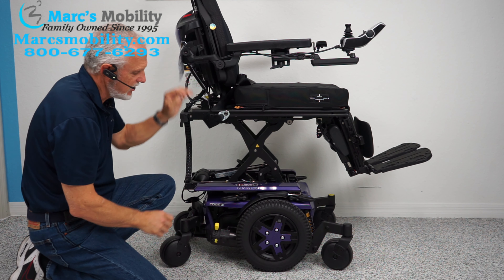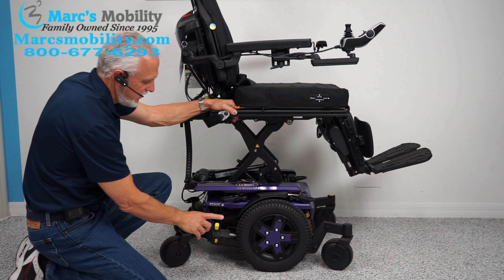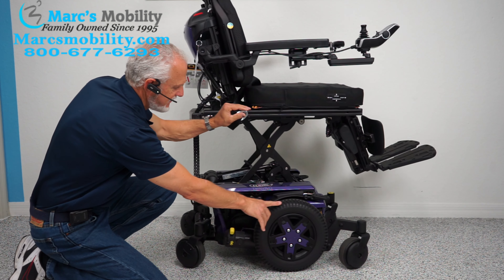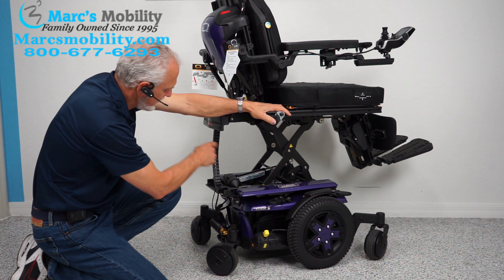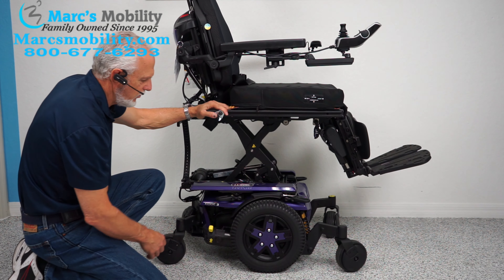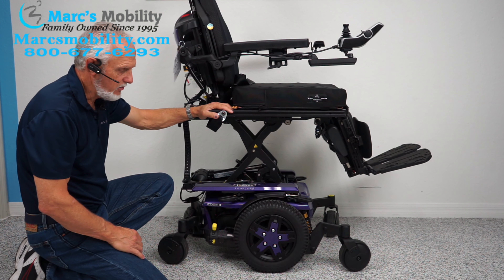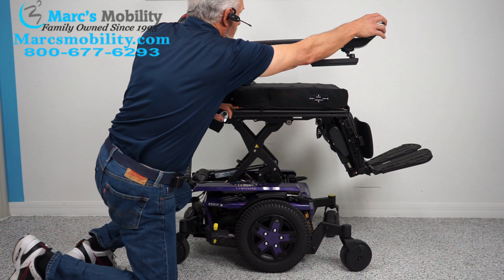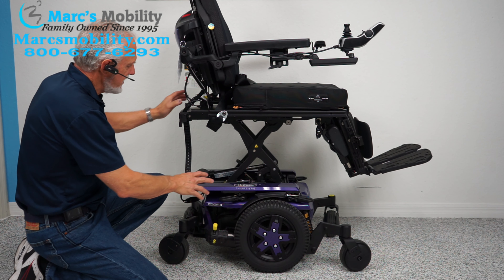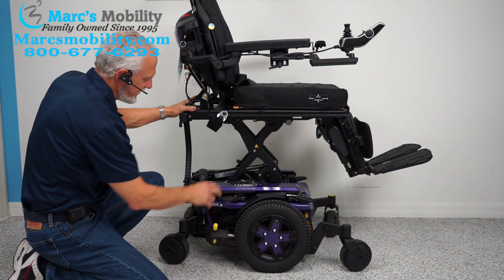At 440 pounds I'm not going to be able to lift or push it if I had an issue. But if you turn the power off — and the reason you want the power off is so you have no resistance in the motor — just hit this yellow lever down. Push it down and it unlocks the wheel. You can unlock both sides and then roll the chair around. When you're done rolling it, put it back in gear, then turn your power back on and you're ready to go.